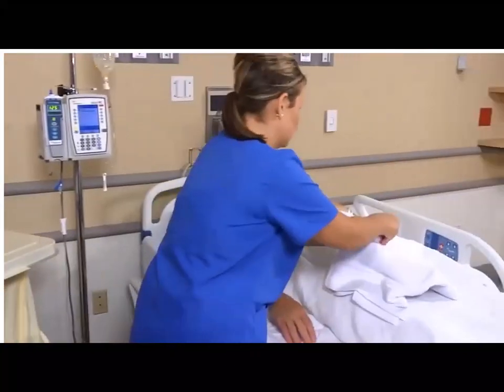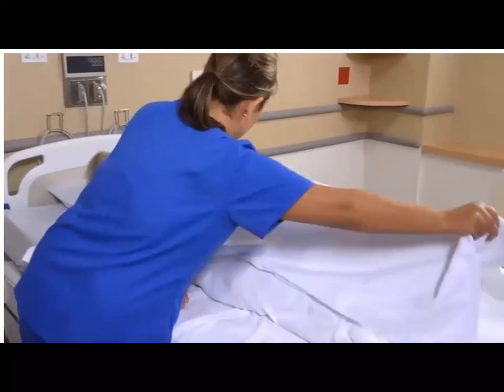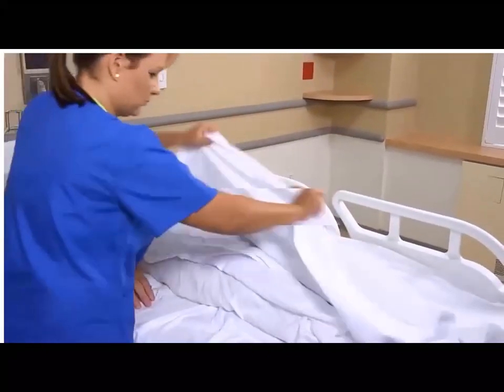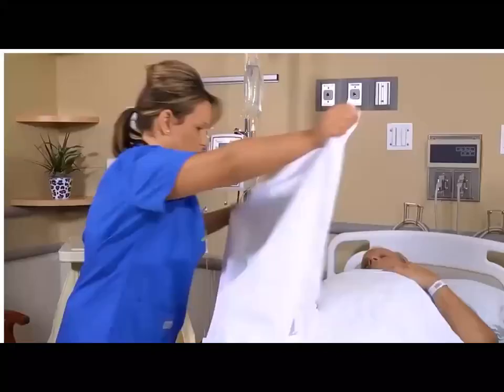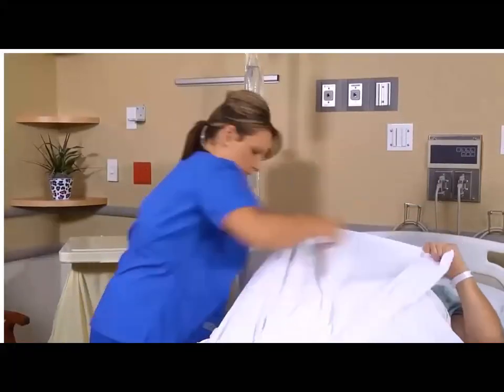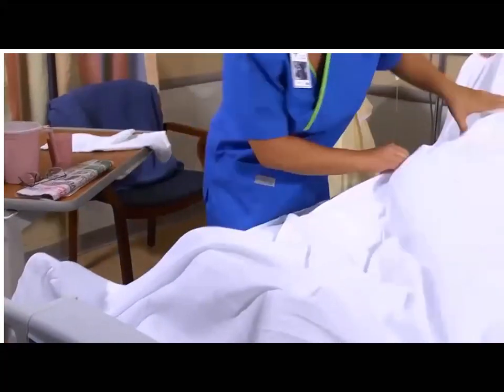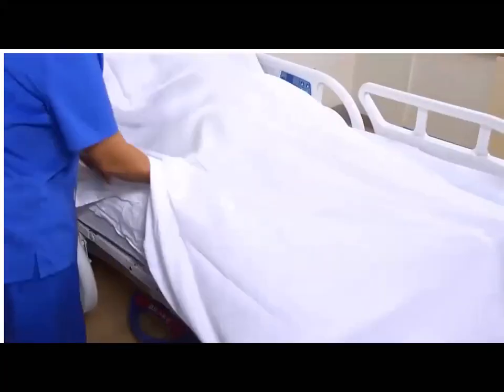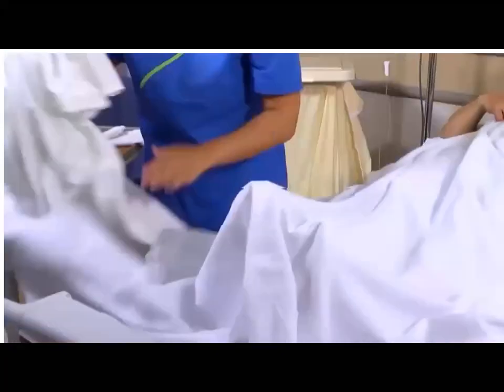Cover him with a top sheet, placing the vertical centerfold lengthwise down the middle of the bed. Open the sheet out from head to foot as you unfold it over the patient. Be sure the top edge of the sheet is even with the top edge of the mattress. Ask the patient to hold on to the sheet and blanket as you remove the bath blanket.